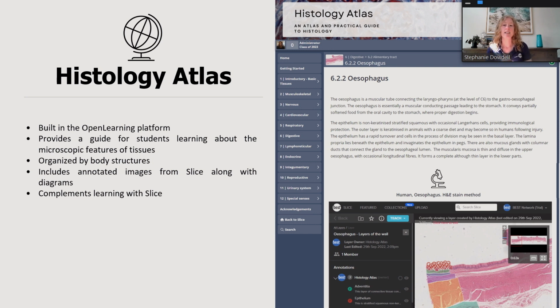We've included annotated images from SLICE along with diagrams and text-based descriptions. And not only is this a great resource for students studying histology or histopathology as part of an existing course, where the atlas complements the learning with SLICE that's created by their institutions and this becomes a reference resource, but it can also be used by new institutions who are looking to set up a histology course, as we have ready-made sets of layers, images chosen, and descriptive information that can form the basis of a course.